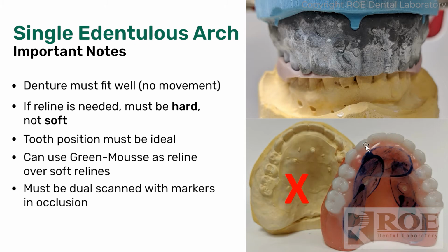The tooth position, we want it to be ideal. It doesn't have to be perfect. We can do some pretty amazing things with our software to change tooth position. And you must have a dual scan with the markers. We'll talk about the scan here in just a minute.